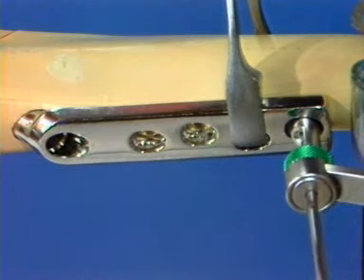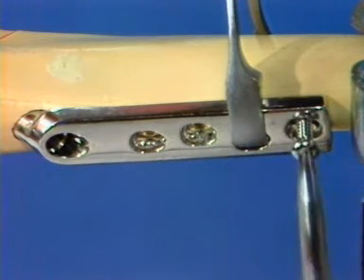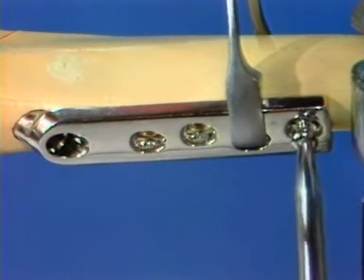The DHS plate is then attached to the shaft of the femur with four screws drilled in the neutral position.